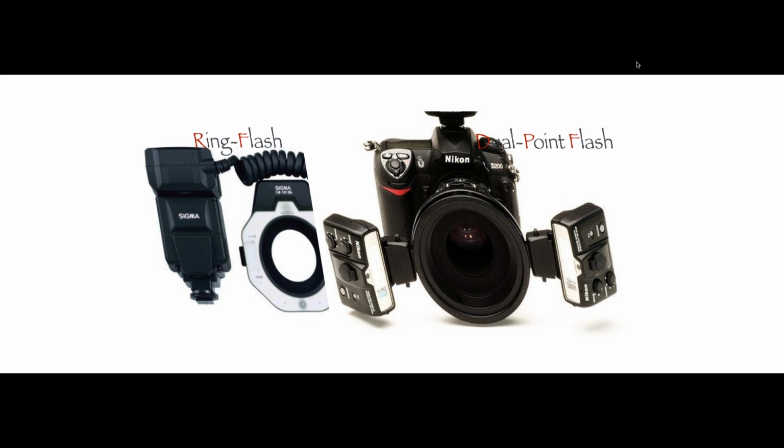So in my case, I'm going to give you as an example myself and Dr. Halo, that we work together. In my case, I have both flashes. I have the ring flash that I use for posterior teeth, and I have my dual point flash that I use for my aesthetic cases. Dr. Halo only uses a ring flash. He does very good photography, but he only uses a ring flash. So he's used to using that flash.